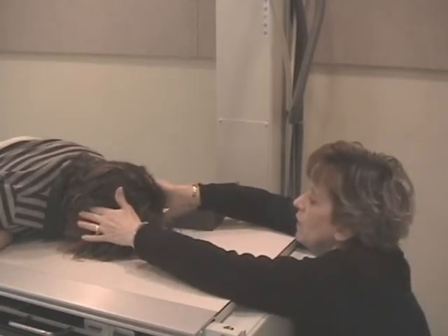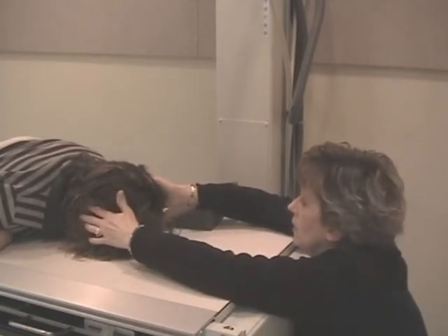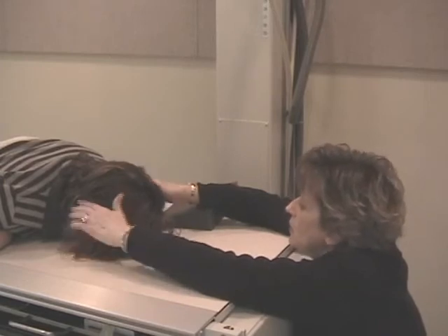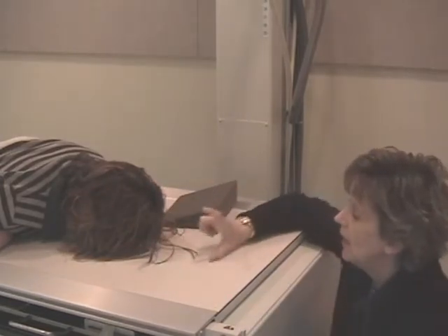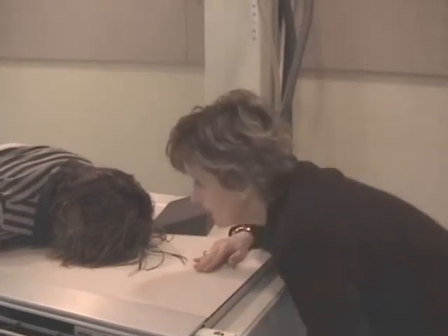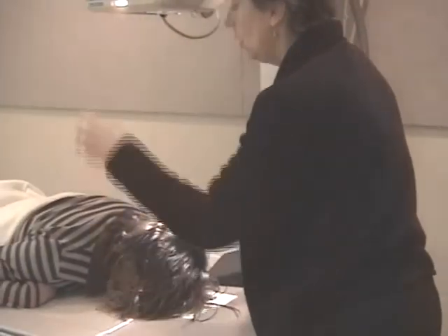Some techs will feel the auricle of the ear, just in front of the EAMs, and again evaluate the height in order to make sure there's no rotation. You can't look at eyes because they're hidden, so you have to feel for some bony landmarks. Collimate.